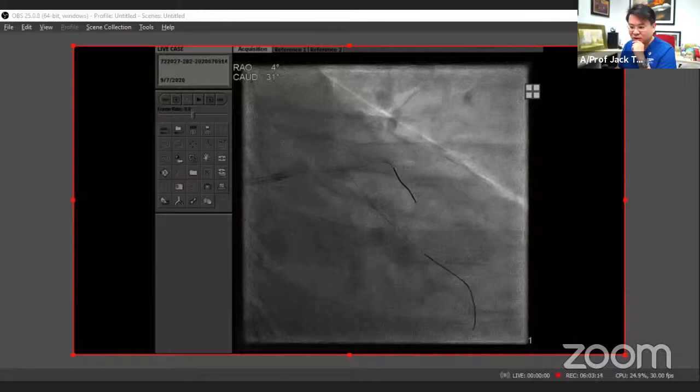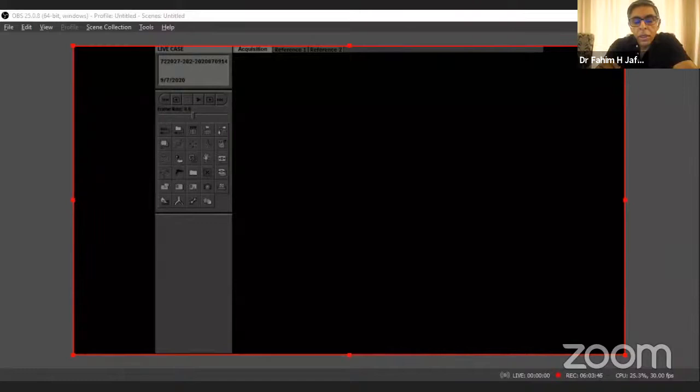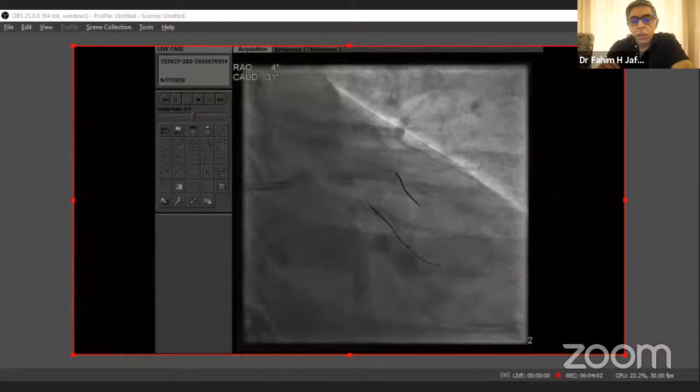There's also a question here in the Q&A from a fellow, Hashru, about, since this angulation is almost 90 degrees, isn't it better for a crush or a TAP rather than a Culotte? So for this question, maybe I can get Dr. Fahim's comment. Will you have done a Culotte here or will you go with some form of crush or TAP? Yeah, I agree. With that angulation, my preference would be to do a DK crush. It doesn't mean you cannot do Culotte, but if you look at the stresses and strains on the stent with such an angulation, you may be better off doing a DK crush. However, as I said, it can be done, and I'm sure Aaron will show us in his usual expert style how well it can be done.